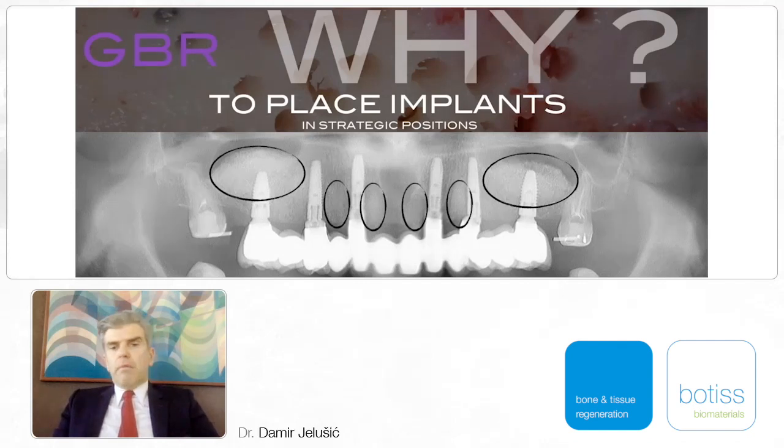You can see here bilateral sinus lifts, and in the middle, with these signs, you can see between every implant one sign which shows the preservation of the alveolus.